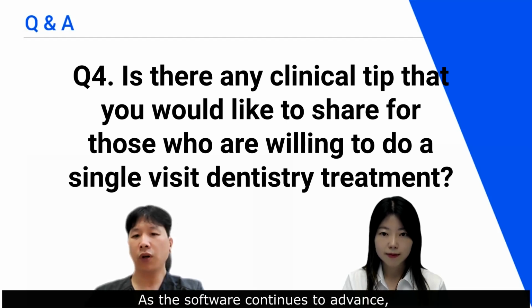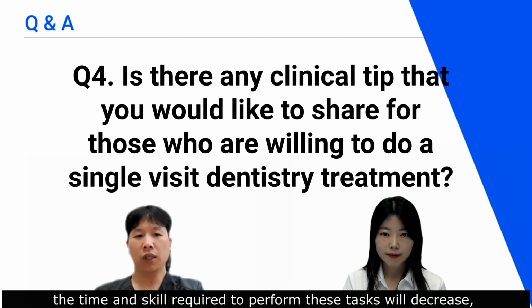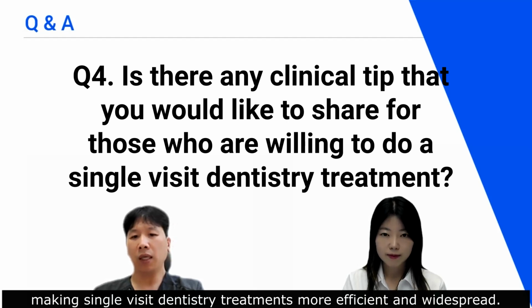As the software continues to advance, the time and skill required to perform these tasks will decrease, making single-visit dentistry treatment more efficient and widespread.